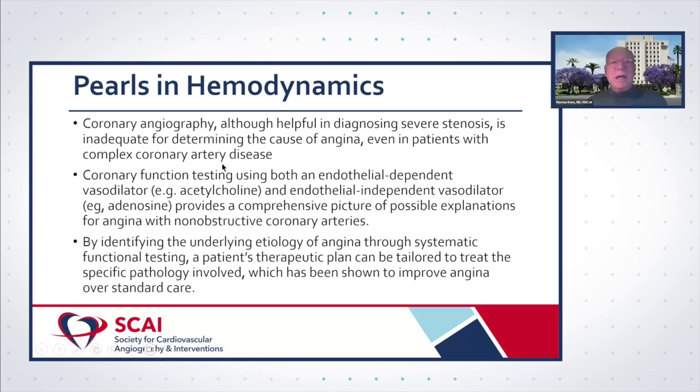Excellent. I'm going to just say I have some reservation about dobutamine in bridges, because with a very mild bridge, you can induce a narrowing which may be beyond that which they get in normal life. And so there's some question about the finding, what it means in real clinical practice. But I think this is the way to do it.